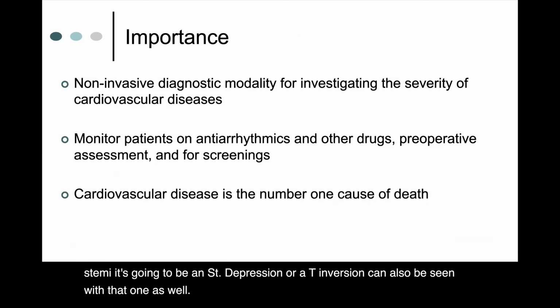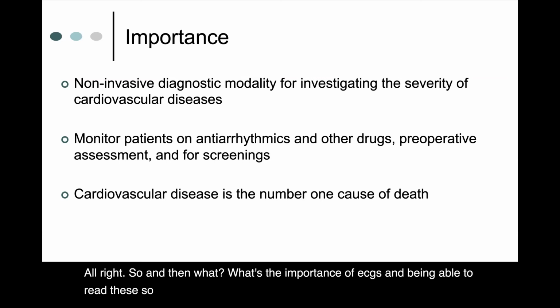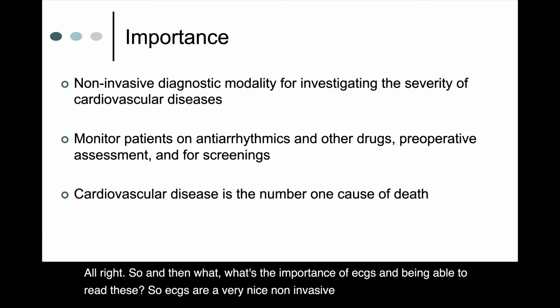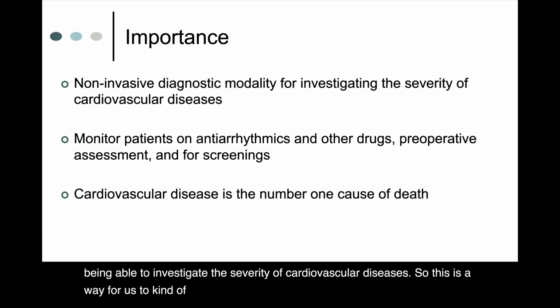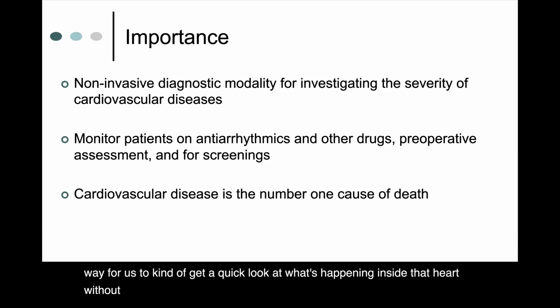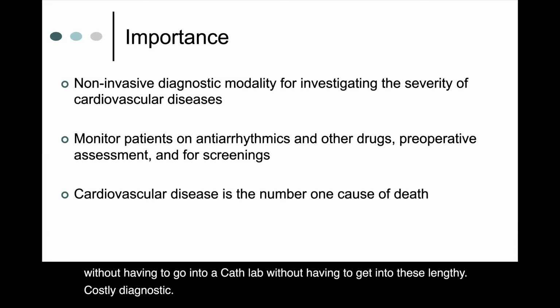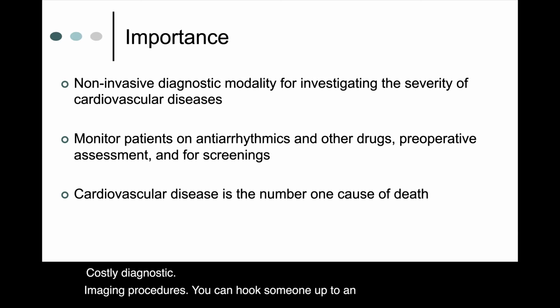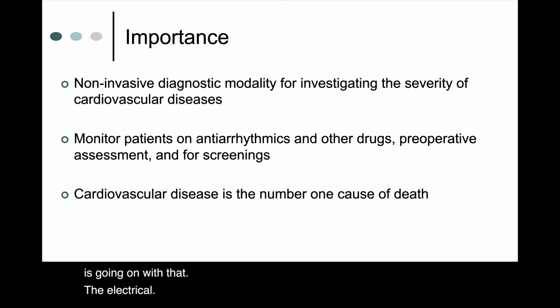All right, and then what's the importance of ECGs and being able to read these? So ECGs are a very nice non-invasive diagnostic modality for being able to investigate the severity of cardiovascular diseases. So this is a way for us to get a quick look at what's happening inside that heart without having to go into a cath lab, without having to get into these lengthy, costly diagnostic imaging procedures. You can hook someone up to an ECG and look at the electrical impulses within the heart.